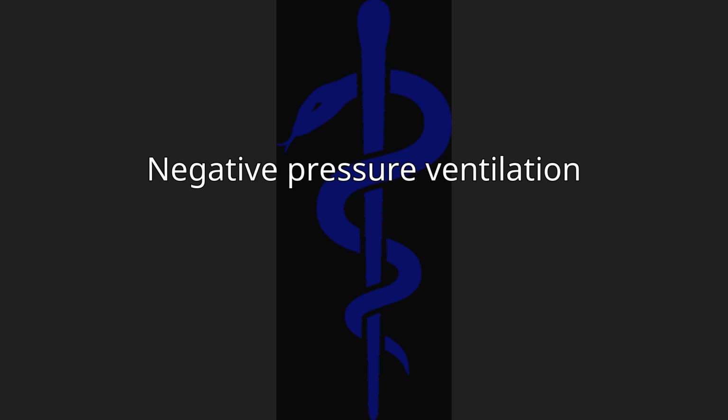Various negative pressure ventilators, or NPV, have been developed to serve this function, most famously the iron lung, a tank in which the patient lays, with only their head exposed to ambient air, while air pressure is reduced on the remainder of their body inside the tank. Though not in wide use today, NPV were the principal forms of hospital and long-term mechanical ventilation in the first half of the 20th century and remain in limited use today.